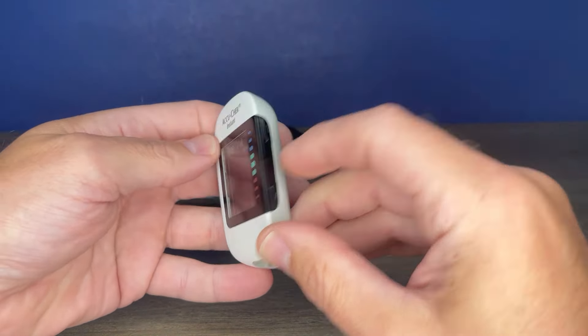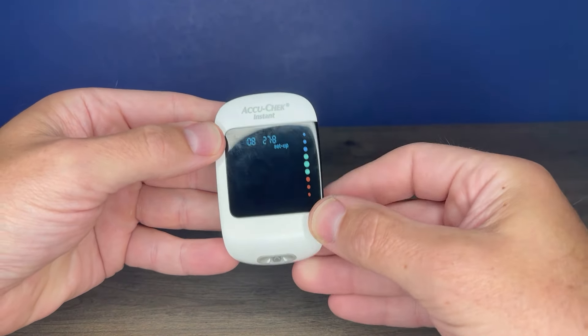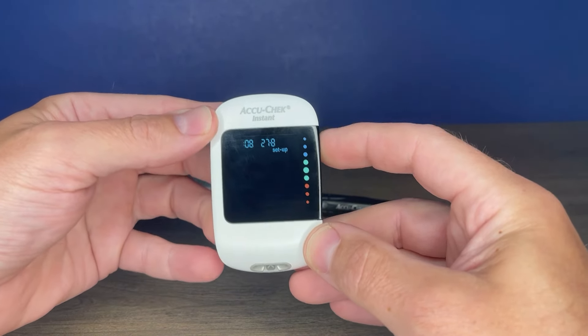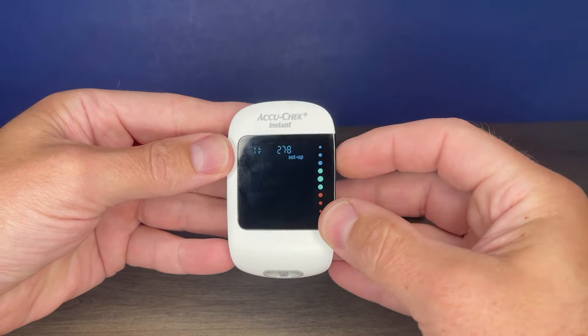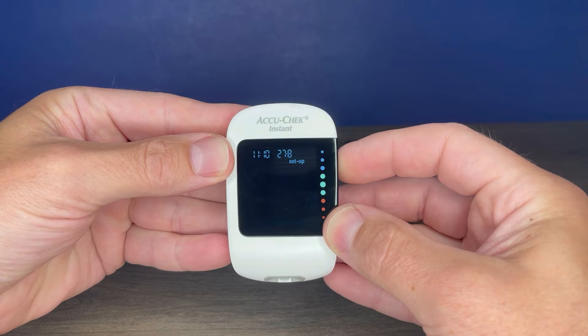That's your option to set up your time. Use the up and down arrows, starting with the hour, to adjust as needed. Once it's set to your local time, press and hold the top arrow button, and then it goes on to minutes. Again, use your up and down arrows to adjust the minutes. Once it's to your liking, press and hold the top button.